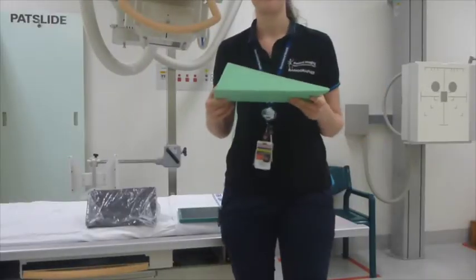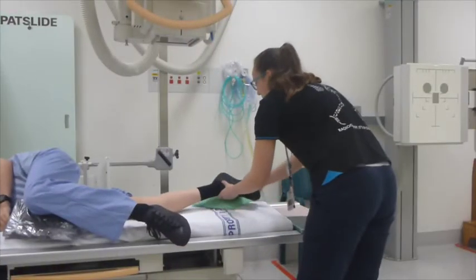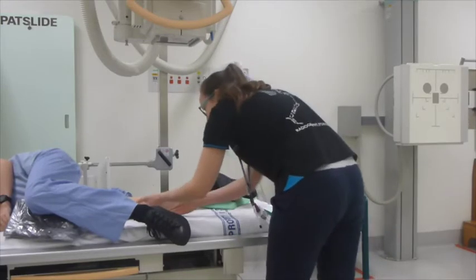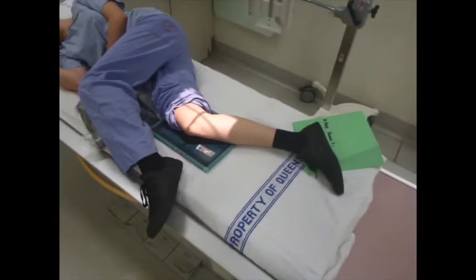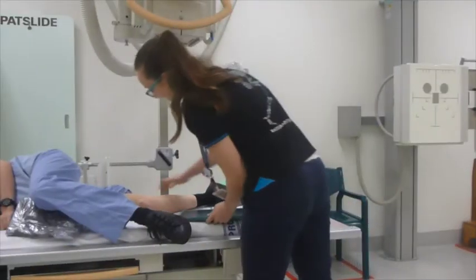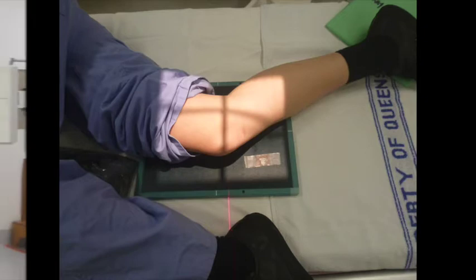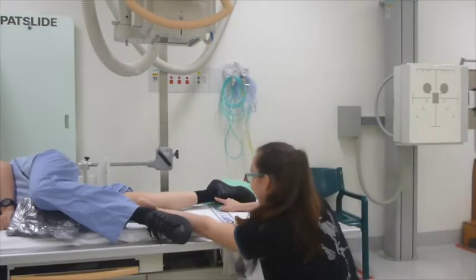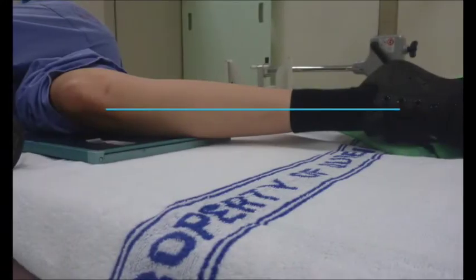Now get the wedge sponge and pop this under their ankle, placed in this position. Next, get the cassette and place this under the knee. It should look like this. You then need to assess the tibia and ensure that it is parallel to the table. If you need to, move the sponge in or out so the angle of the ankle is more or less.